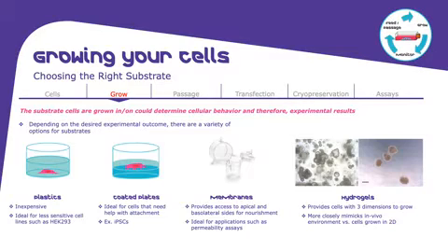such as HEK293, for example. Sometimes researchers realize that the cells do not feel so comfortable and need a little bit more help in order to grow and divide. In this case, researchers will pre-coat the surface with attachment factors such as collagen, fibronectin, or laminin. These two are traditional two-dimensional cell culture.